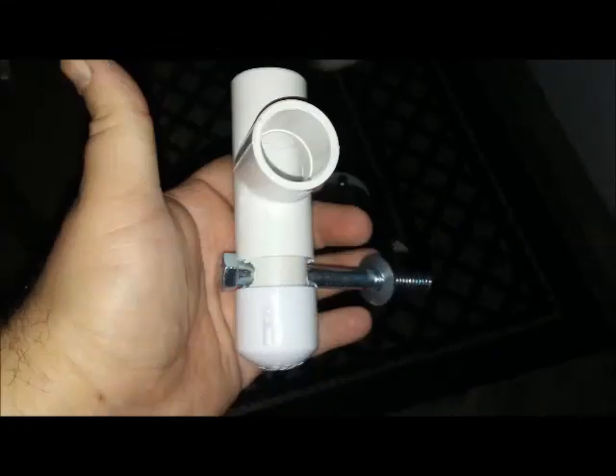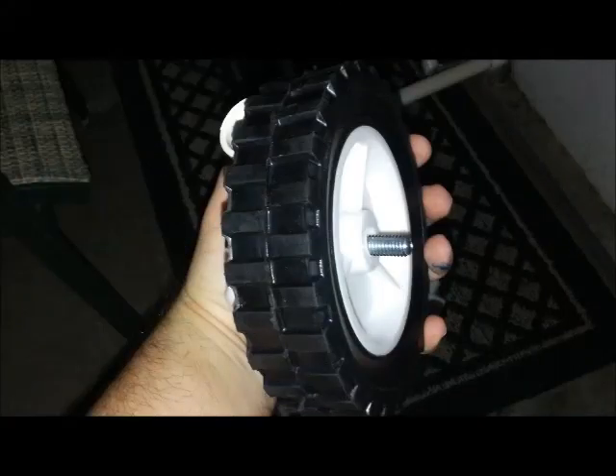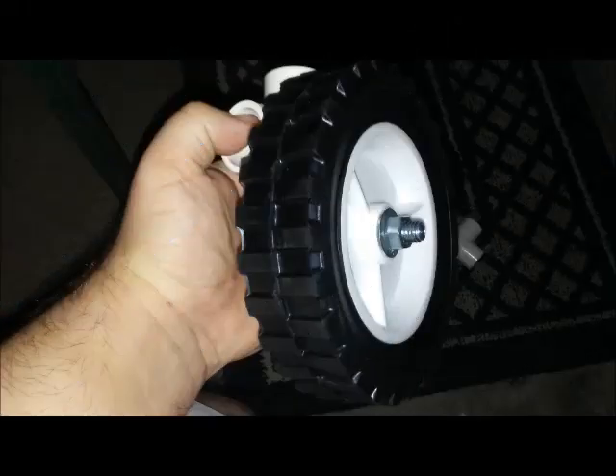That rod is a number twelve bolt. Then you're going to put in a number thirteen washer, then insert the tire on top of that. Then put the next washer on the outside of the tire, and finally put the number fourteen nut on there to hold it in place. That'll protect the tire and give it some extra stability.